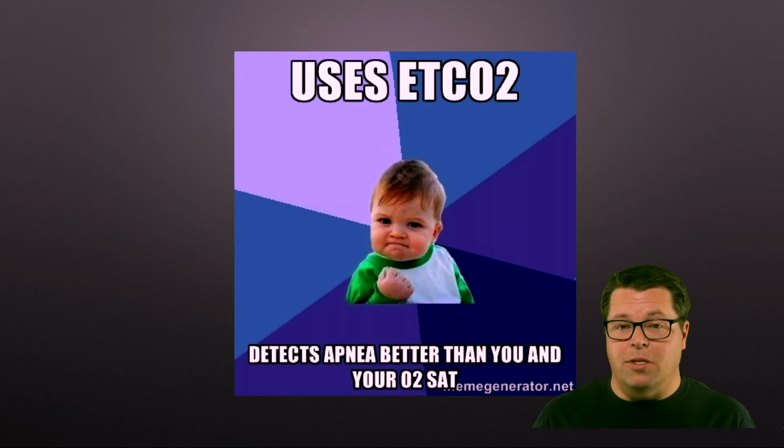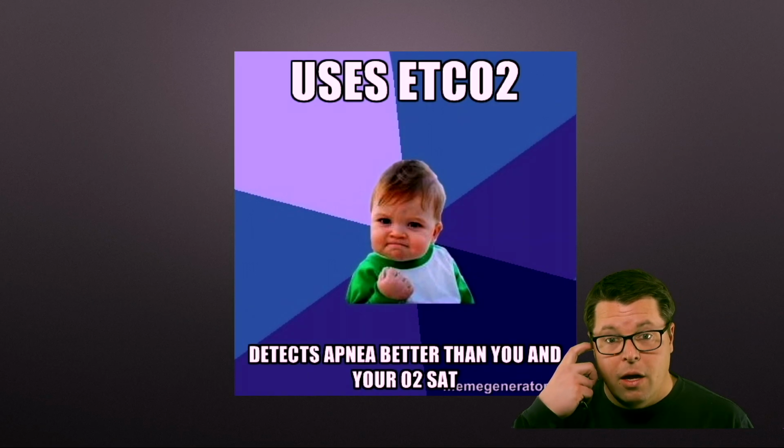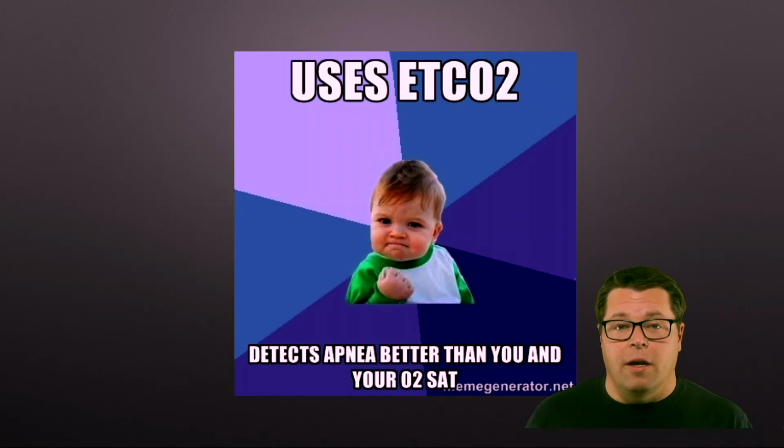So say you give somebody a bunch of ketamine and you're using end tidal CO2 to monitor whether or not they are breathing, you're going to figure that out a lot faster than if you were just watching their sat, and a lot more reliably. Let me prove to you a little bit of that. So let's watch this poor devil here.